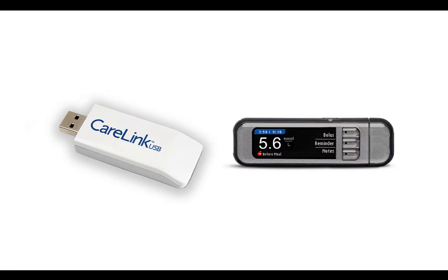To begin, plug in your CareLink USB or the meter that came with your insulin pump. Use the white CareLink USB for Paradigm pumps or the black CareLink USB for MiniMed 600 series pumps. It may take a few seconds for your computer to recognize it.